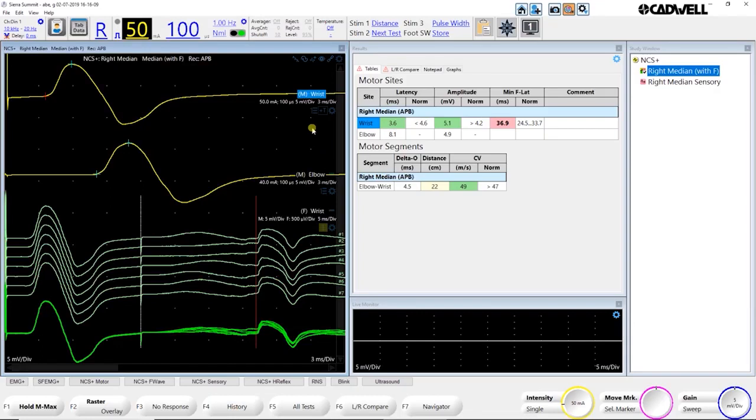You can even do another trial. So let's say we wanted to maybe move an electrode and see if we can get a better response on our wrist. So what we can do here is right under that site we have a cogwheel, a plus T, and a trace history. The cogwheel is just the site settings. The plus T gives us a new trial. So I'm going to hit plus T.